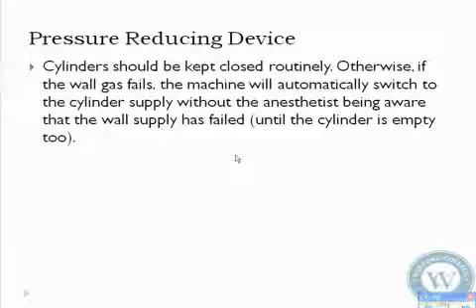So at the beginning of every day, you go in, you turn it on. Turn it on to the left, righty-tighty, lefty-loosey. So turn it on to the left, open the cylinder. You only leave it open for about 3 seconds or so. You'll hear it go whoosh. That's all. Once you hear that whoosh, it has pressurized that high-pressure system. It's gone up to the gauge, and it stopped. And at that point, that gauge pressure is good for the rest of the day. So you don't do it every time you have a new patient come into the room. You just do it once a day.